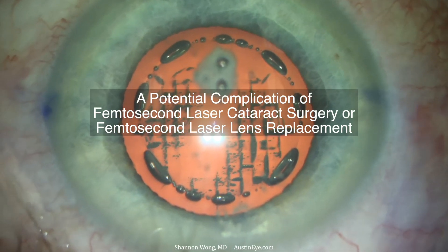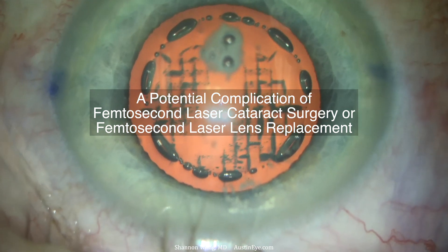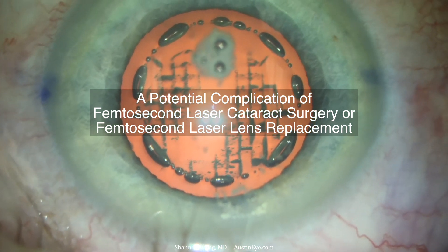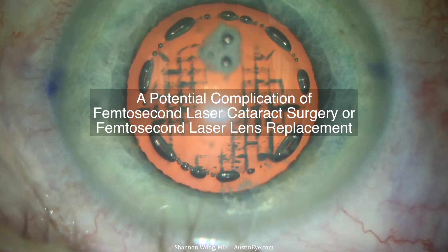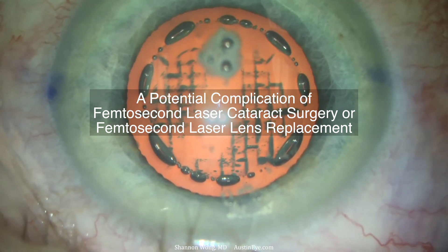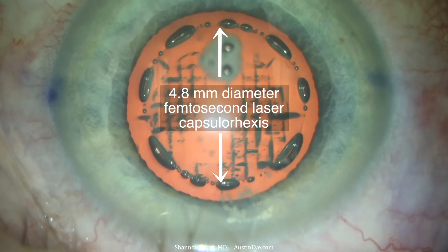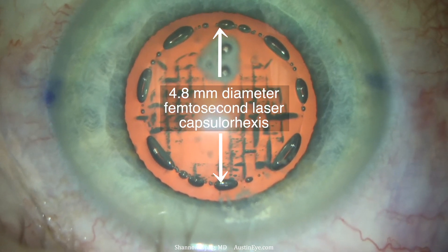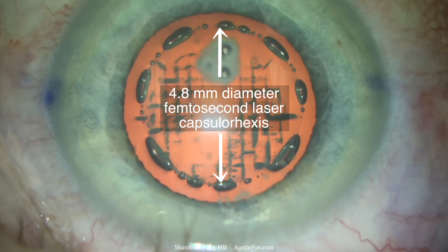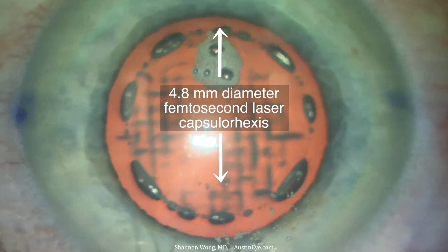This case is interesting because it illustrates a potential complication of femtosecond laser cataract surgery, or in this particular instance, femtosecond laser lens replacement using the LensX femtosecond laser.